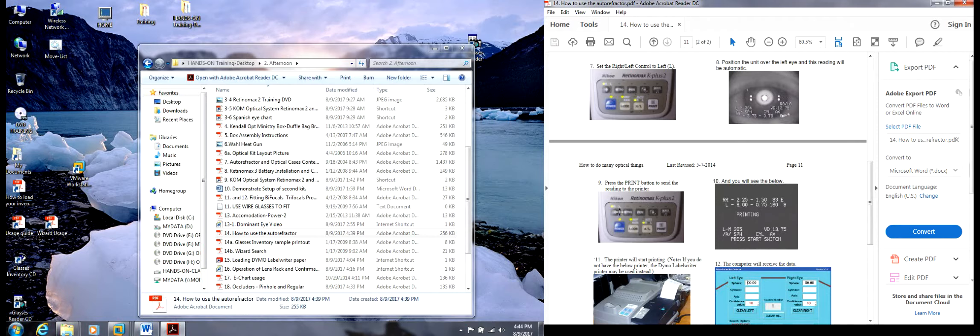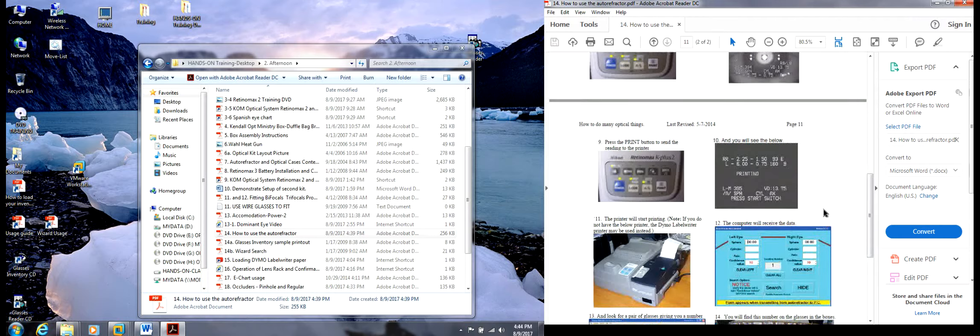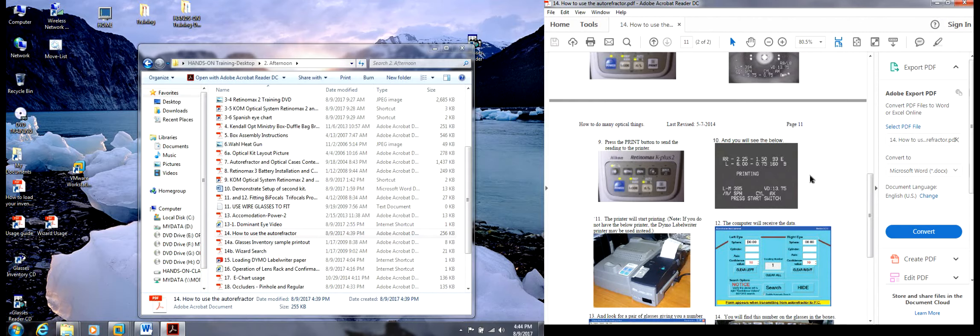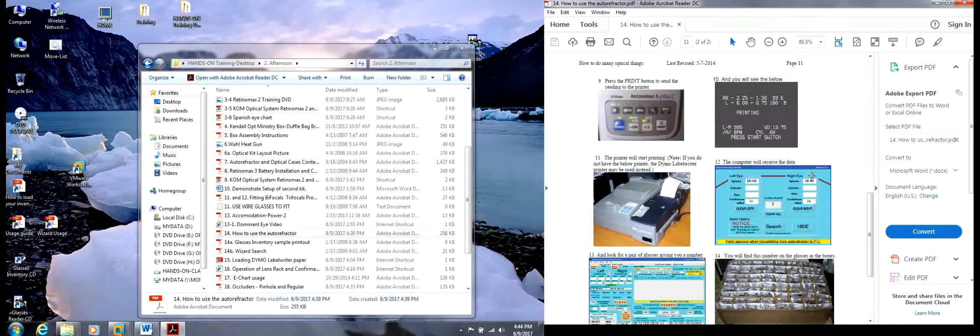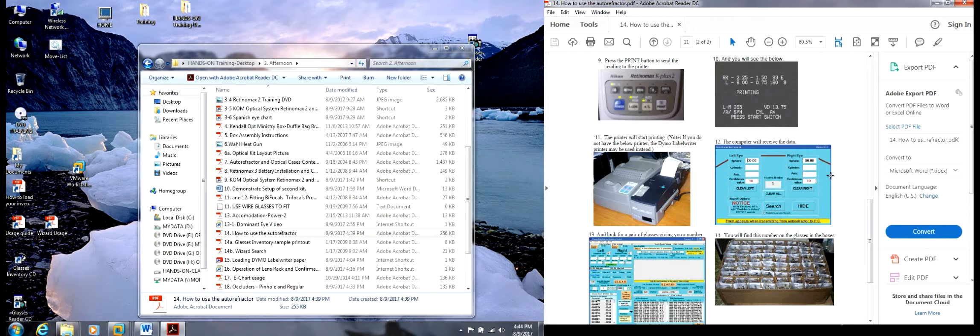You press the print button to send the reading to the computer. You'll see this on the Retinomax 3, it's a little different view. The printer will start printing if you have an attached printer, which most of our kits do not—all but one.